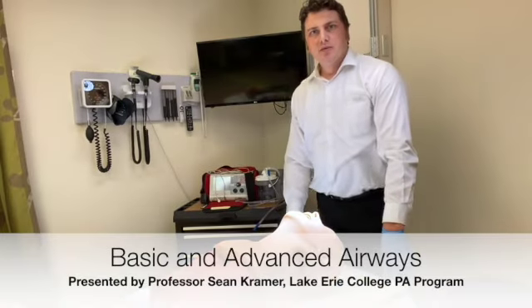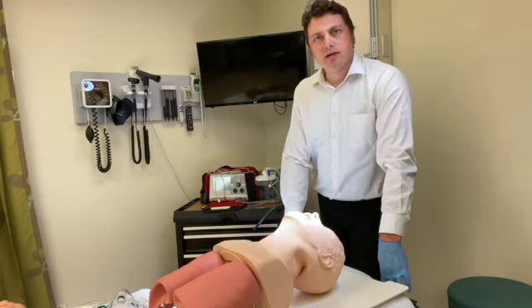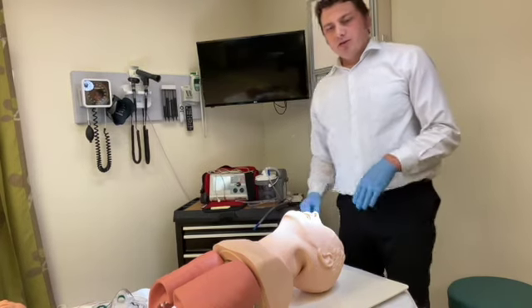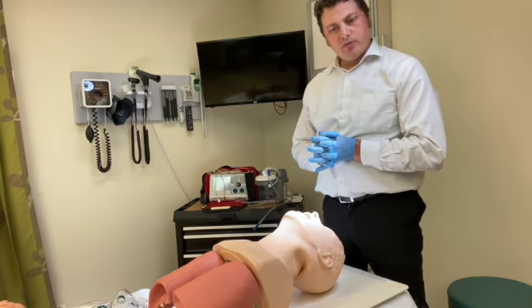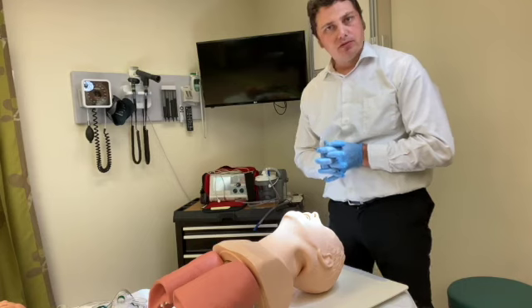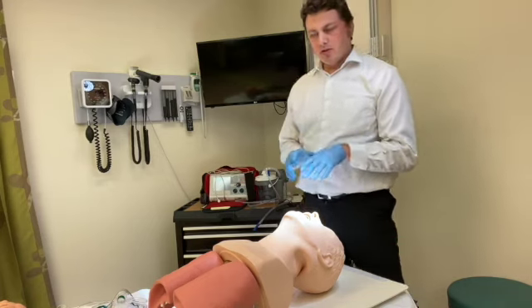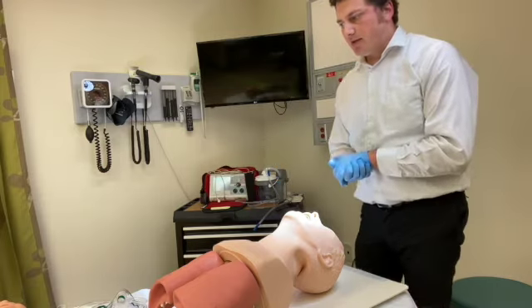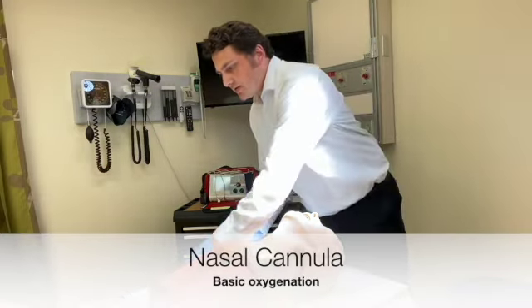Hello class, today I'm going to be demonstrating the basic airway and advanced airway adjuncts. So this includes nasal cannula, bag valve mask, nasopharyngeal airway, oropharyngeal airway, laryngeal mask airway, endotracheal intubation, Yankauer suction, and bougie.